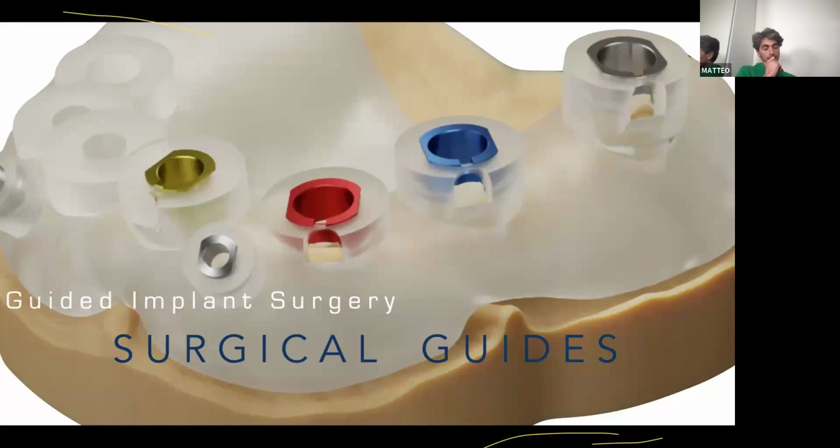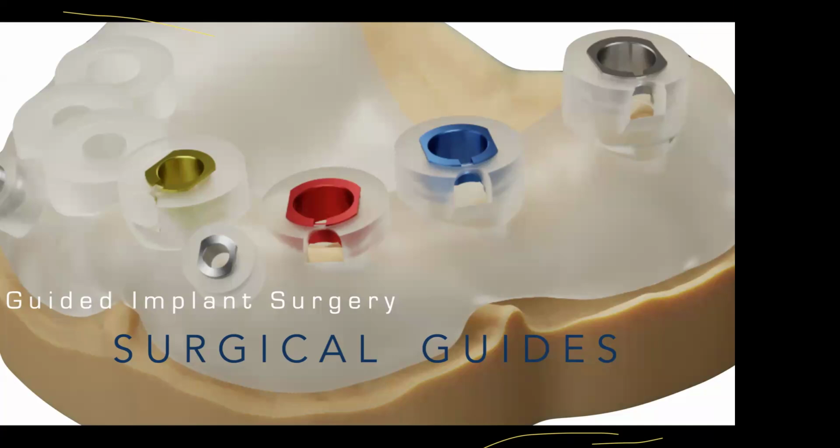So we have to talk a little bit about surgical guides and which type of surgical guides we could use.